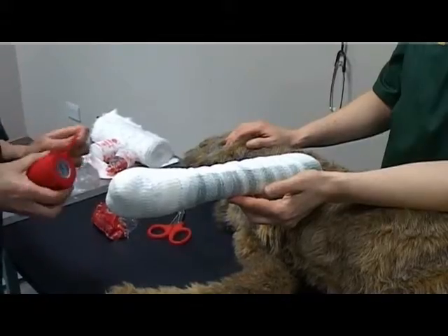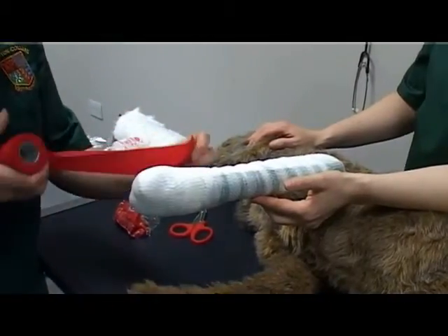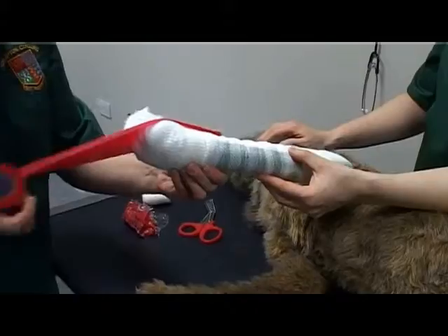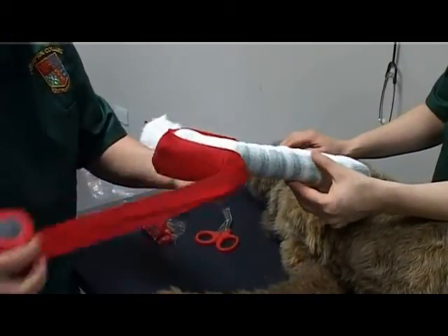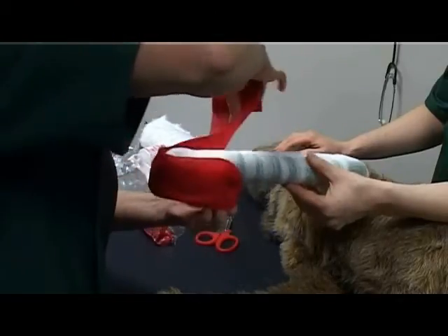Apply an outer protective layer. Check suitable tension of the bandage, pulling out and laying the bandage without any tension from the foot to the top along the length of the leg.